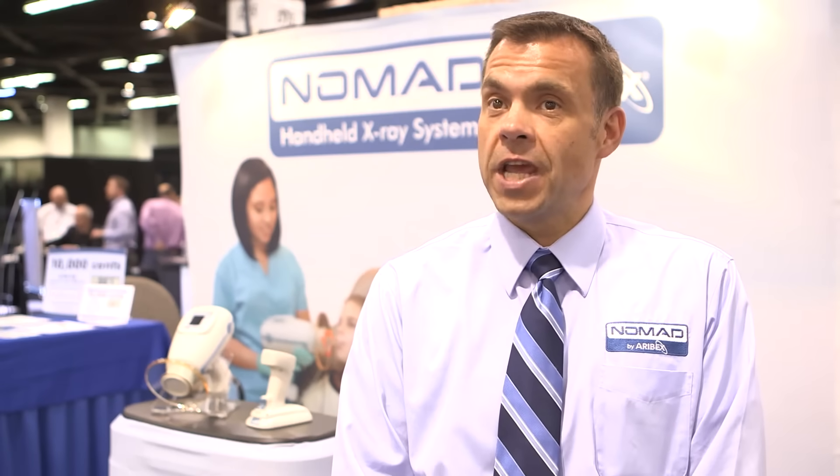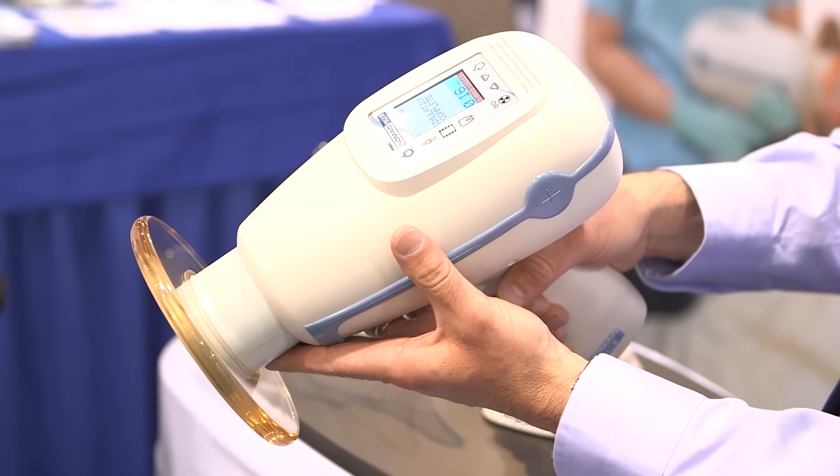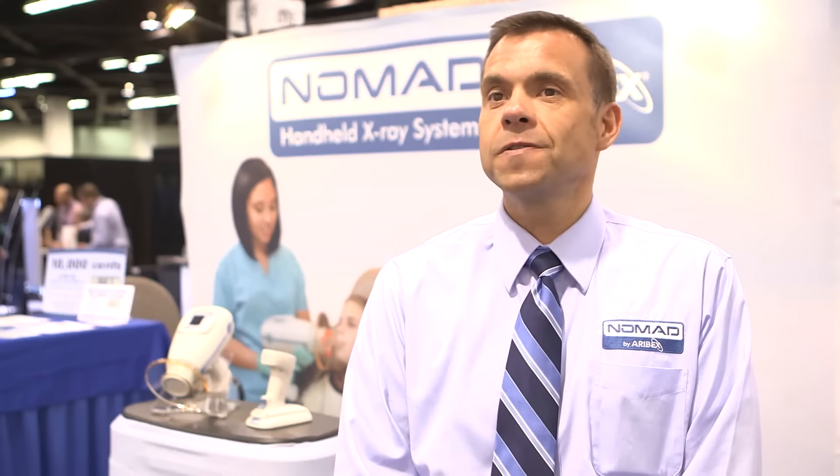With its handheld design, you don't have to leave the patient. You can stay in the room. The unit itself is fully shielded, so it's safe to hold and use. We have a backscatter shield that will capture any backscattered radiation that may be coming from teeth, crowns, or bone. So as an operator, very safe to use, very low dose, safe for the patient.